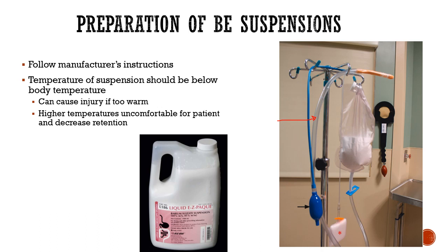As far as the barium suspension, which is shown here, we put it into that bag and we want to follow manufacturer's instructions. Temperature: the suspension should be below body temperature. It can cause injury if it's too warm, and higher temperatures are uncomfortable for the patient and decrease retention. And by the way, here's the clip we were referring to in the previous slide that holds the barium in the bag until you're ready for the study.